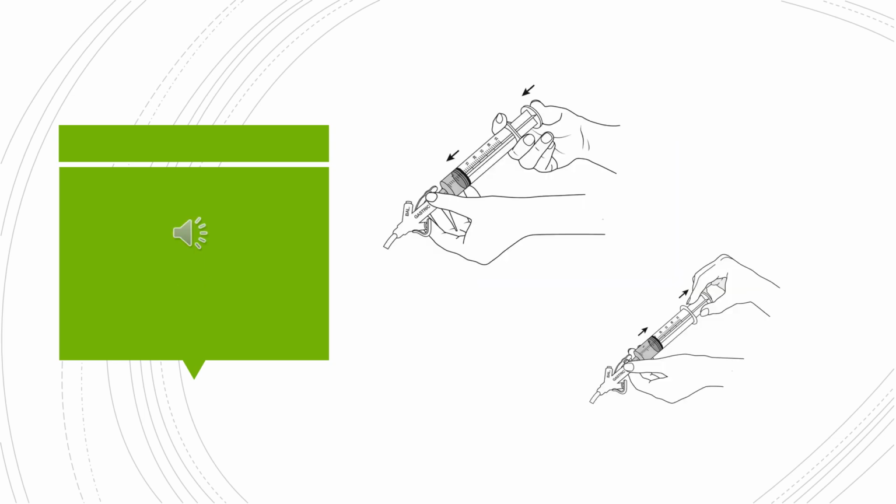Medicines or liquids can plug a feeding tube if it is not flushed out correctly. It's important to flush with enough water before, after, and in between giving medications. It's also important to flush the tube at least every 4 to 6 hours if someone is on a continuous tube feeding. You should flush with enough water to clear the tube of any contents seen in the tubing. And you should also flush each time you disconnect or reconnect the tube from the button.